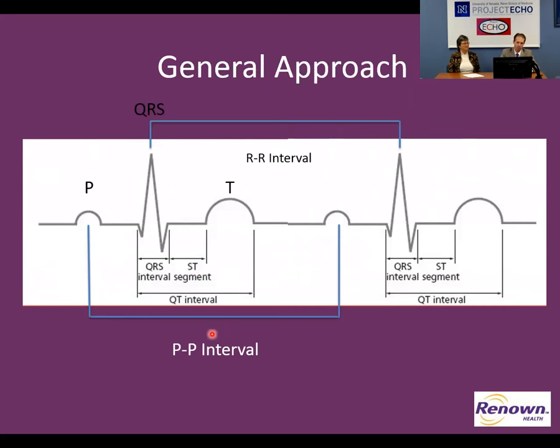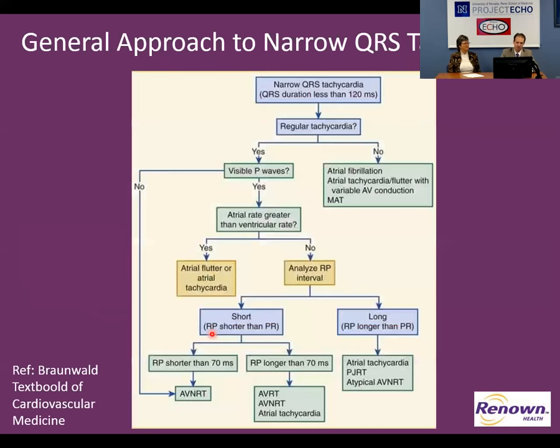And then, of course, we talked about QRS axis. I briefly initiated a discussion about QRS axis. Remember, P waves can change their axis too. And so there's a few things to look at when you're thinking about an EKG. I'm not going to go through this algorithm exhaustively. It's posted on the website. Please reach out. We're happy to go through it.